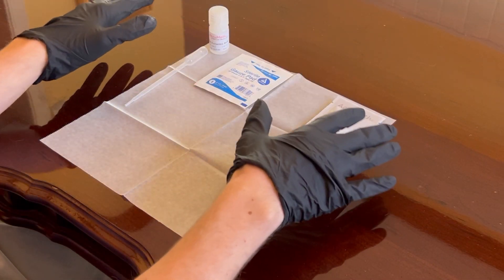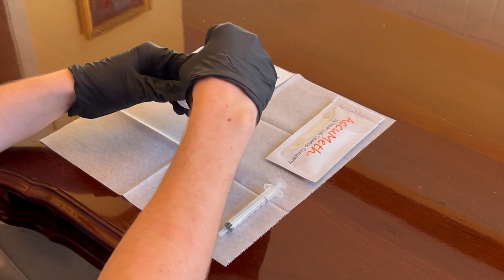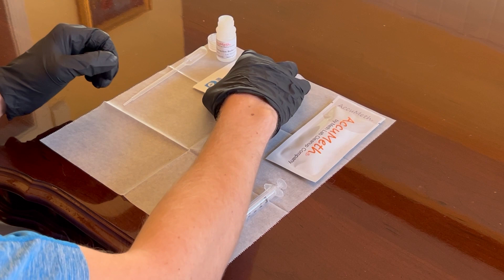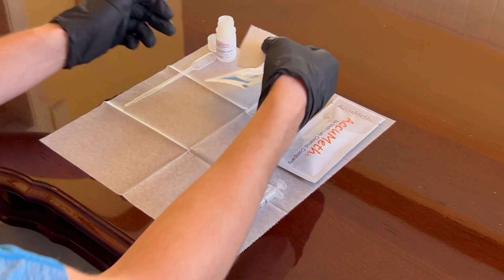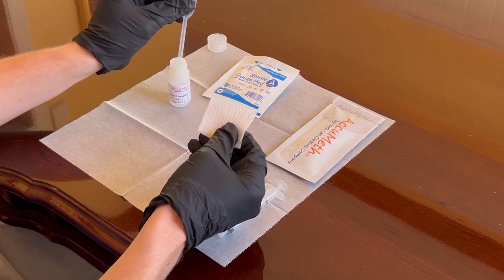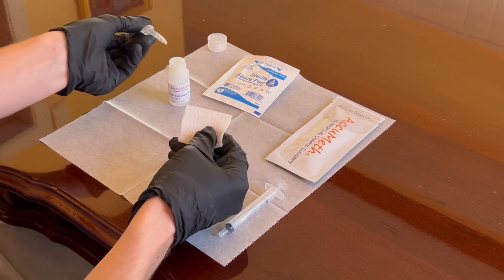Now that we have our nitrile gloves on, place the test and all test components out on the supplied wax paper. Open the meth extraction buffer bottle and put the open bottle aside on the wax paper, exercising care not to spill the liquid buffer. Place the cap adjacent to the bottle. Remove the gauze wipe from its packaging and hold it in one hand. Use the pipette, which looks similar to a mini turkey baster, to draw the meth extraction buffer into the pipette. When you've done this, hold the pipette tip slightly up so that the buffer does not drip out.